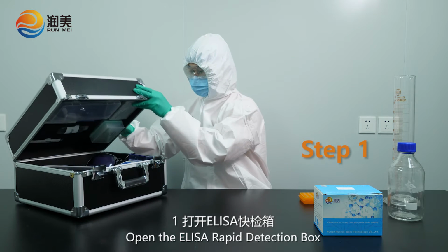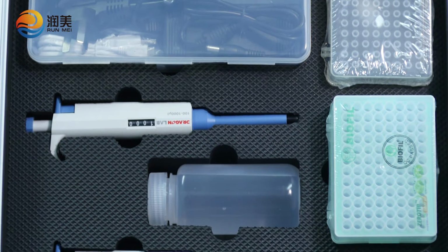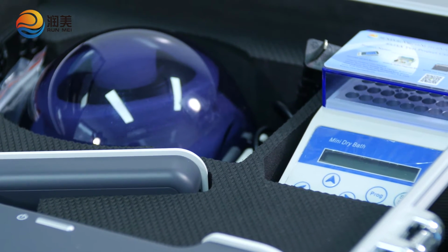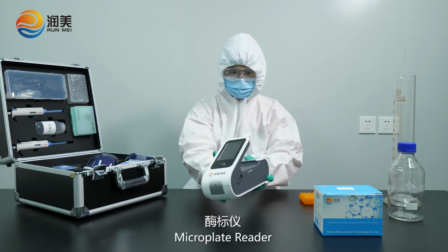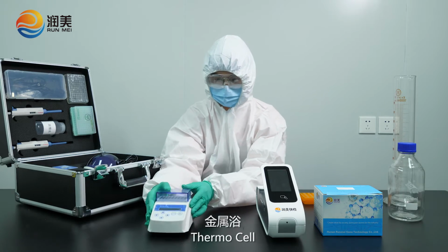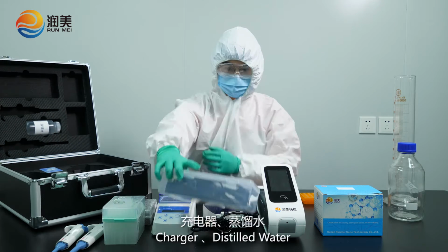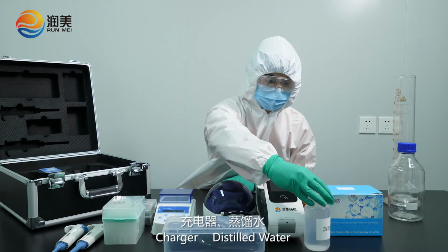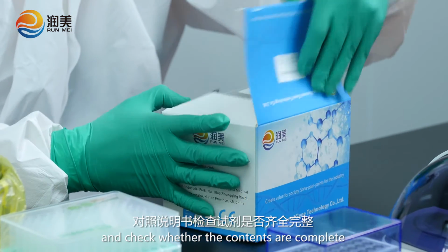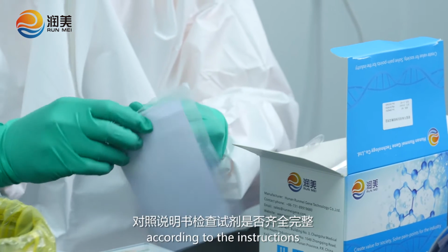Open the ELISA Rapid detection box. Microplate reader, thermal cell, centrifuge, pipette tips, pipette gun, charger, distilled water. Open the ELISA kit and check whether the contents are complete according to the instructions.